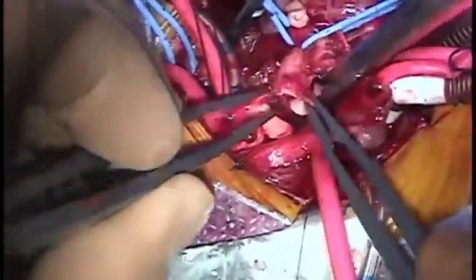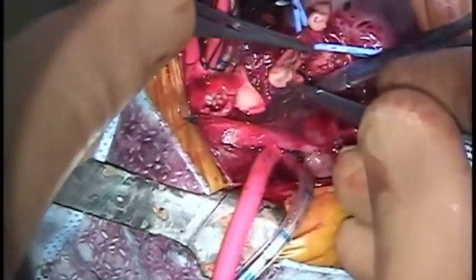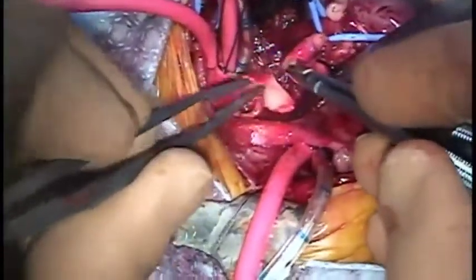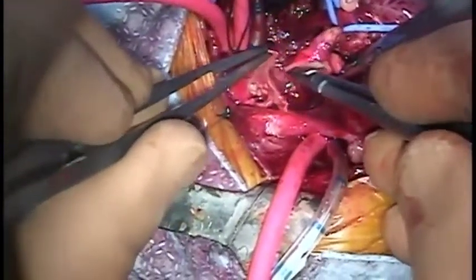The cuts in each successive aortic segment and the radial position of each anastomosis is carefully reassessed at each step to ensure that satisfactory geometry of the arch is achieved once it's filled with blood. Note that the position for the coronary arteries has not yet been selected.